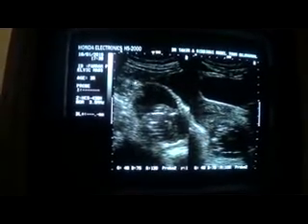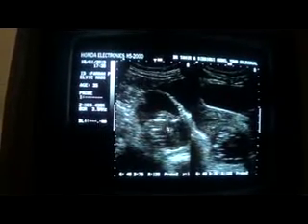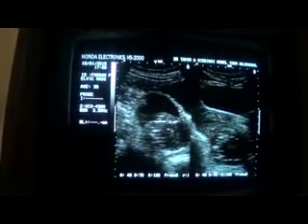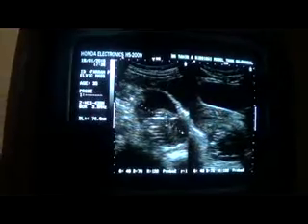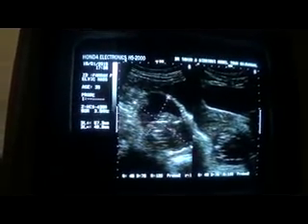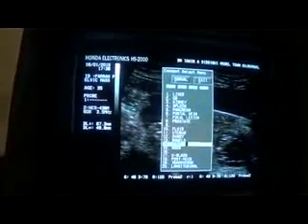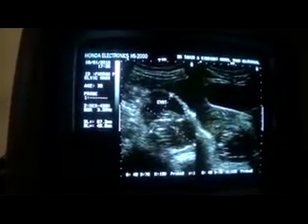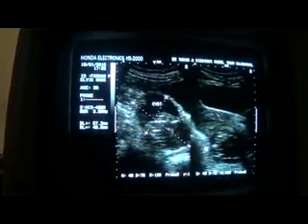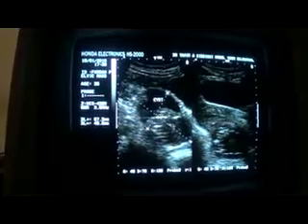This is the wall of this cystic area with multiple internal echogenic particles as well as echogenic material within it, and in this scanning plane it measures approximately 8.7 by 4.9 centimeters. This is in fact a loculated cystic pocket with debris and multiple tiny internal echogenic particles within it. These are all echogenic particles giving no shadow at all.